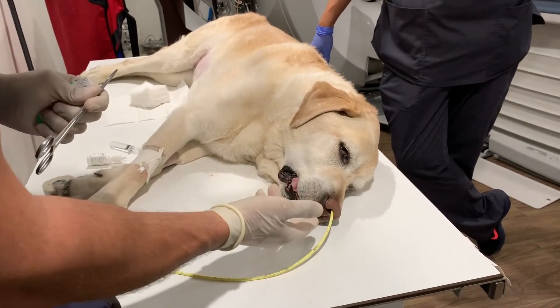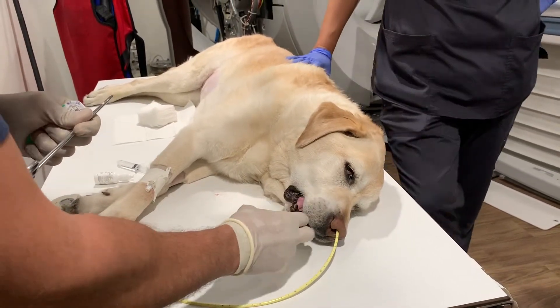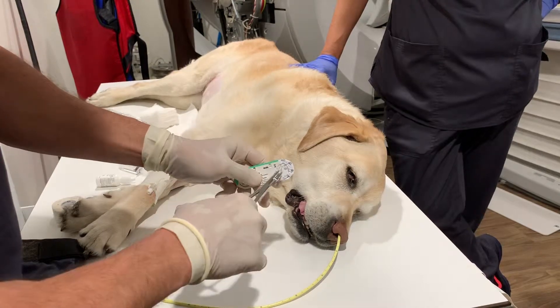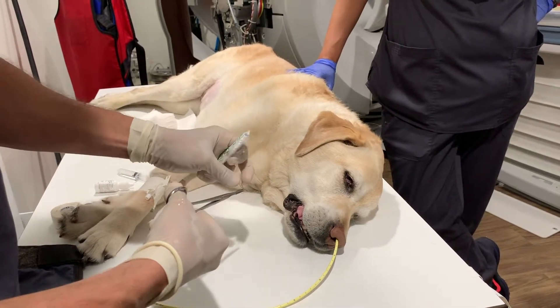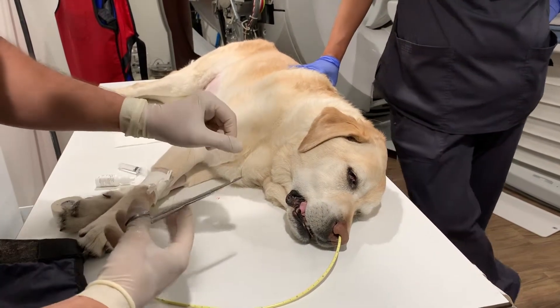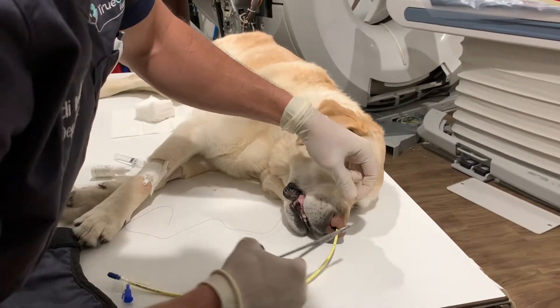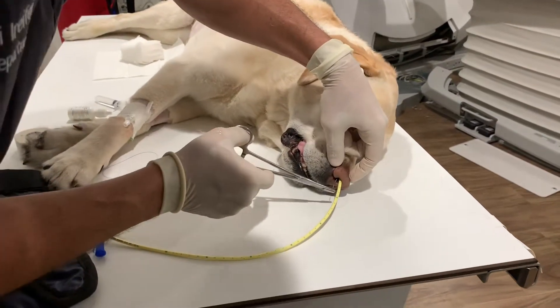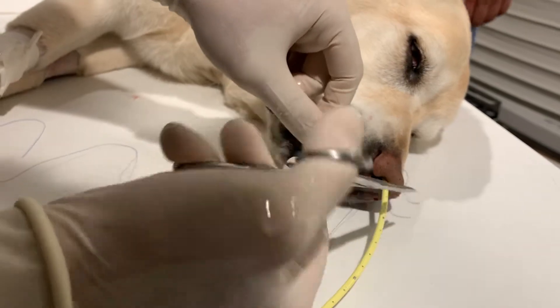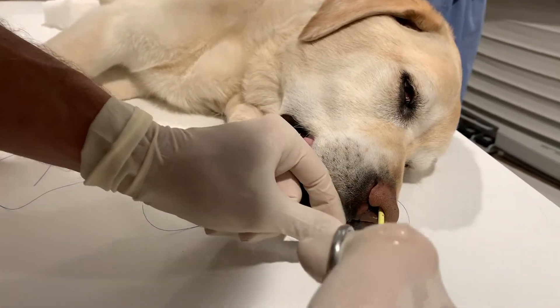Now your veterinarian is going to secure the feeding tube. We have the feeding tube in the nostril — in this case Jackson's right nostril was a better fit. All the veterinarian is going to use is some needle holders as well as some suture. The key is to make sure the pet doesn't pull the feeding tube out. A dog, unlike a human being, doesn't understand why a feeding tube is being placed, and so they'll try to pull it out. There are different ways of securing a feeding tube — I tend to be a little more aggressive. It actually goes straight through the nose; I know it looks dramatic, but the pets under sedation don't really seem to mind it and it doesn't really hurt them afterwards. It's just a small pinch, almost like getting a blood draw.